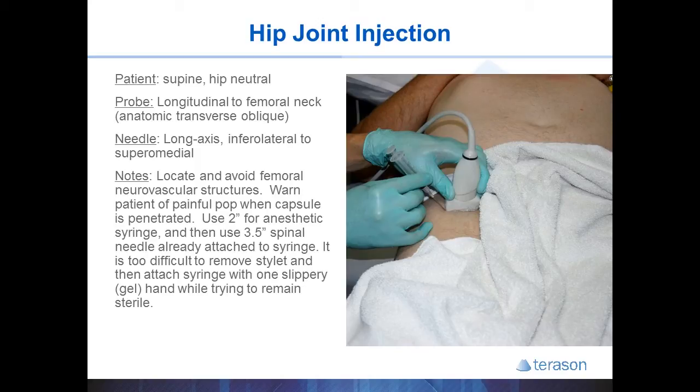You will likely need a 3½ inch spinal needle to reach the hip joint. I find it very helpful to remove the stylet and have the 3½ inch needle already attached to the cortisone syringe. It is just too difficult to drive the needle, remove the stylet, and screw on the syringe with slippery gel on the gloves, all while trying to remain sterile and hold the probe in position — it's just better to have the syringe and needle already attached.